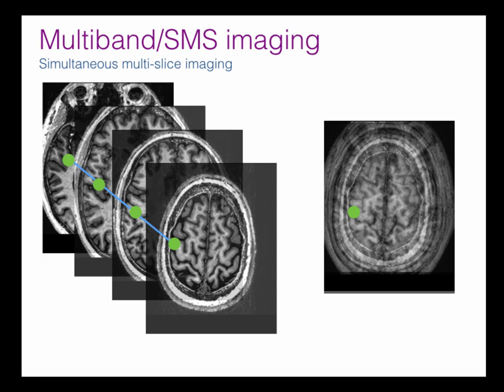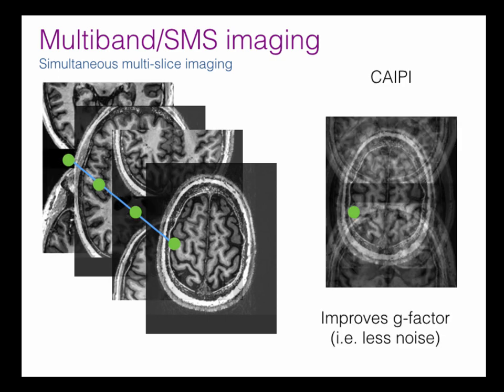Okay. Something you can do to help that invertibility is apply tricks during the image acquisition process to stagger the images so they're not acquired directly one on top of the other, which increases the separation between the corresponding samples and improves the invertibility of that matrix. This is a method known as CAIPIRINHA, or CAIPI. So you'll often hear people talk about CAIPIRINHA during image acquisition.